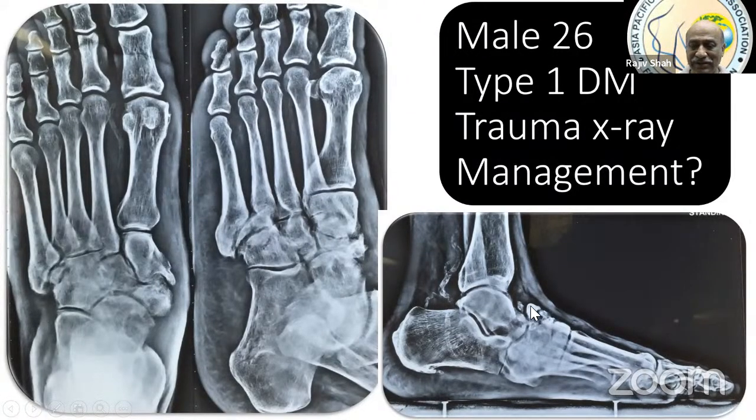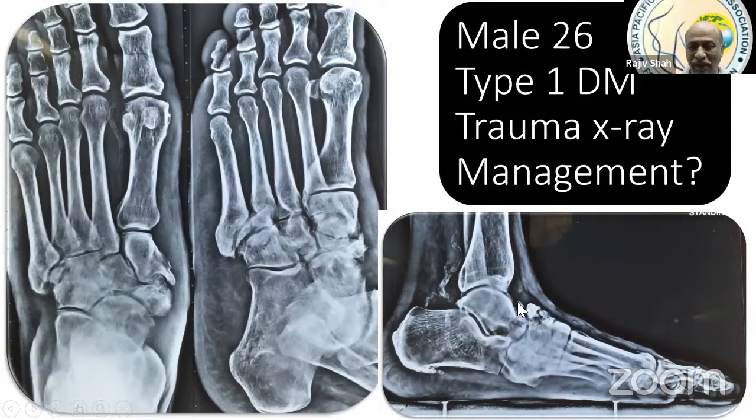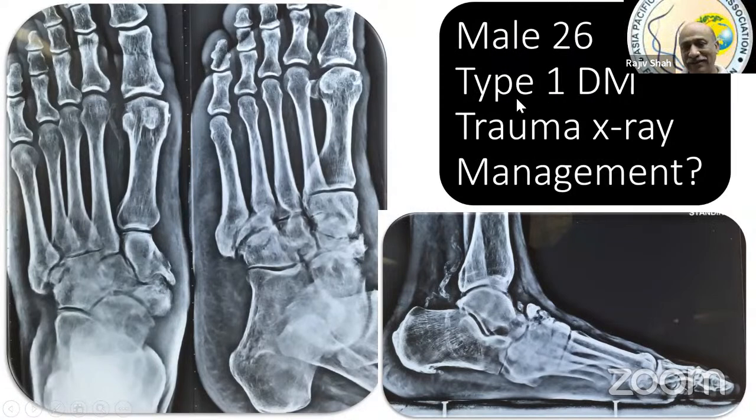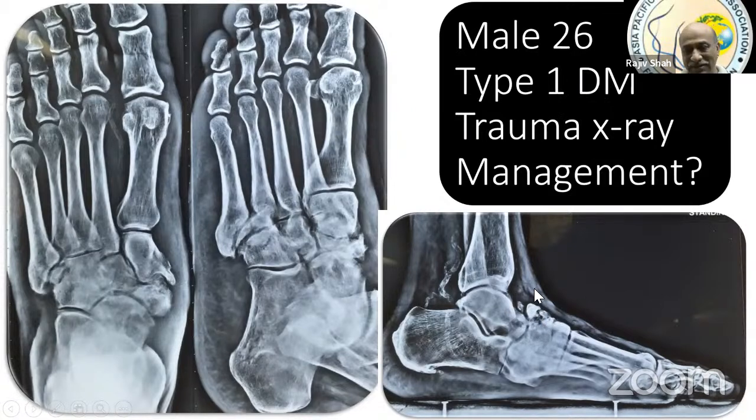And can you see this? Yeah, flakes of bone. Okay. Can you see these dilated vessels here? 26 years. Yes, yes. But it is type 1 diabetes. Yes. Probably he might have had it for a long time. Long time. So this is suggestive of Charcot. Something going wrong, Charcot. So that was not fusion. And can you see this?